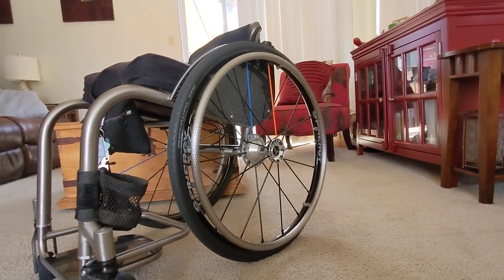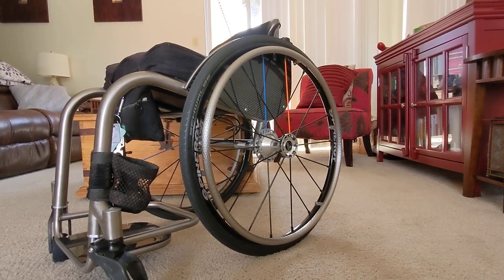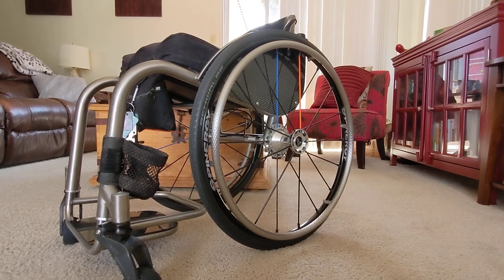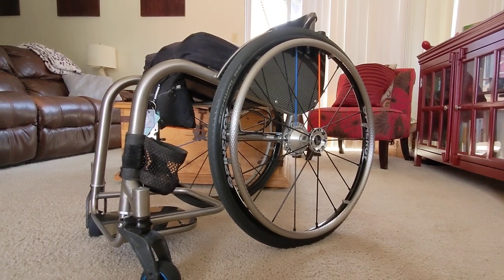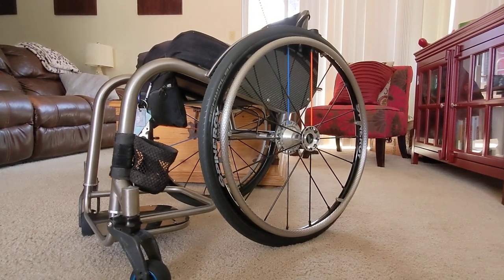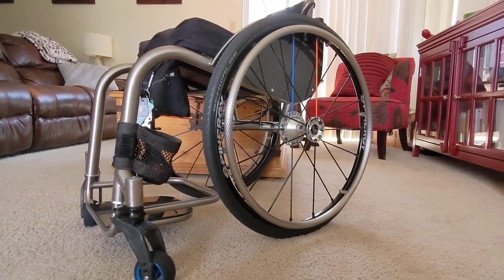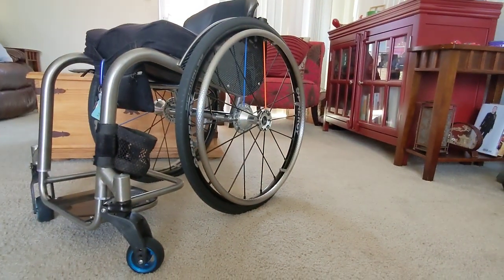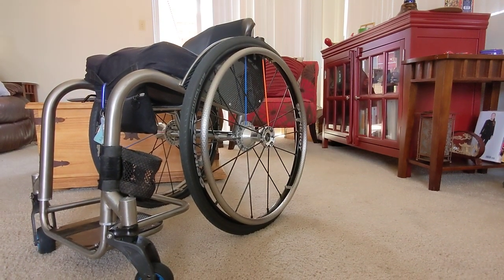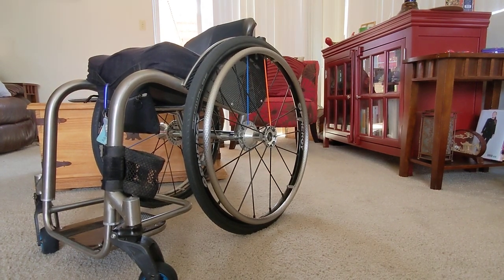My custom-laced Spinnergy Sport LX wheels are an 18-spoke wheel — super rigid, and I've loved Spinnergy wheels for years. The guys at Hands-On Concepts laced them for me with blue and orange spokes. You can see the Deslox hubs in the middle. I also went with the TC push rings, also produced by Spinnergy — a stainless steel push ring with a texture coating.